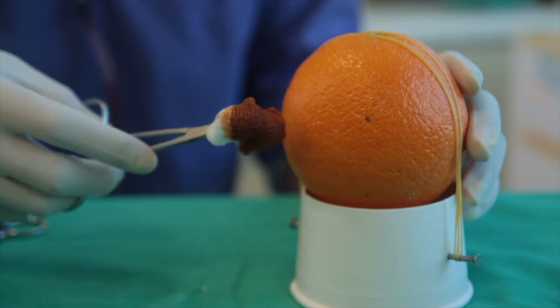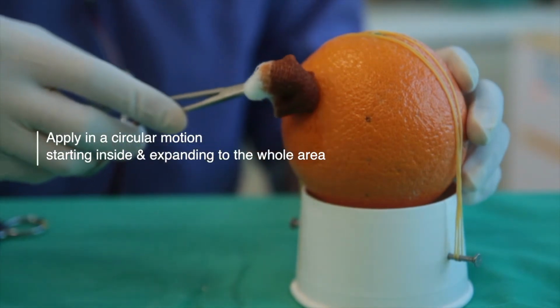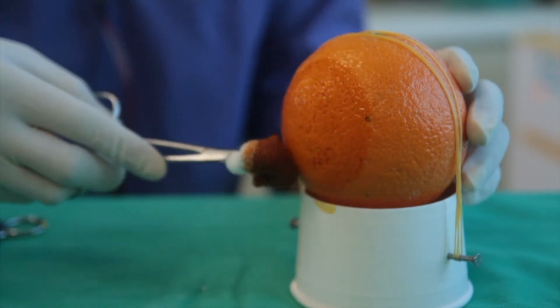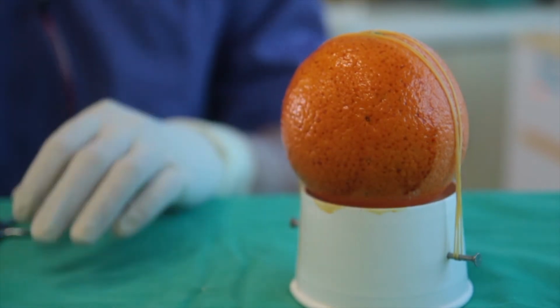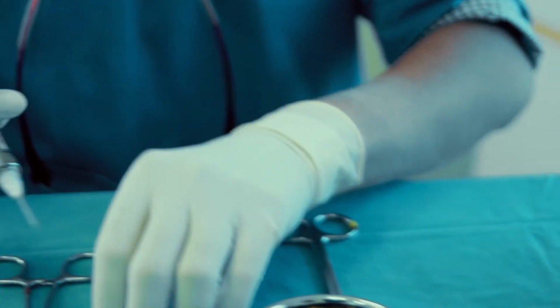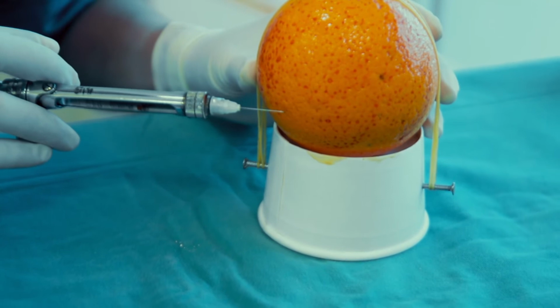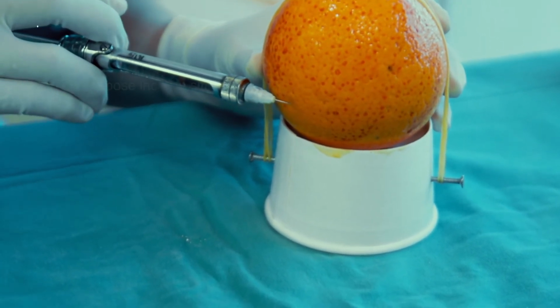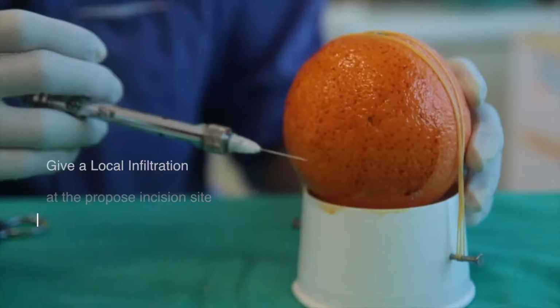To apply the antiseptic solution, we start by applying it inside and moving it outside of the area, and let it dry for a few seconds. Next, we give the LA infiltration to the area. Make sure it just goes superficially in the skin and leave it for a couple of minutes.